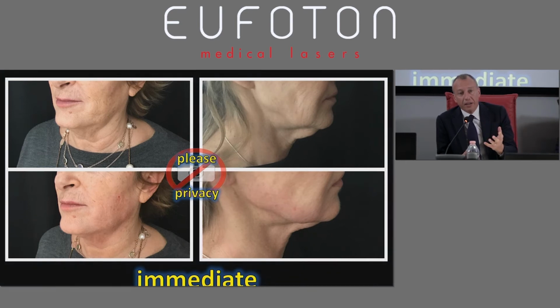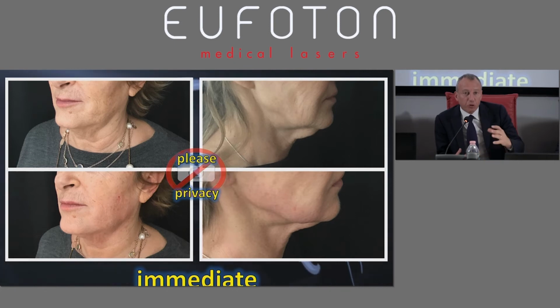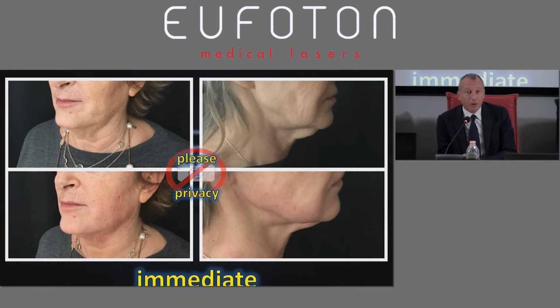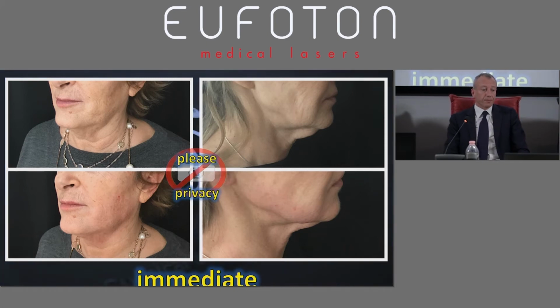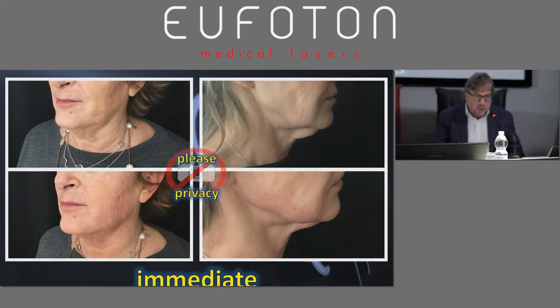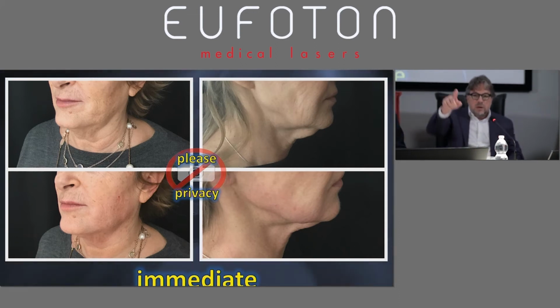If the tissue is very thin, it's much better to make the tissue tightening with the Endolift. When the thickness is much thicker, you can just have a sort of fair play. It's not key to do this before. You can do the two at the same time. First, Endolift before any other method, because when the imbibition is local, it's more difficult to make a very effective Endolift.